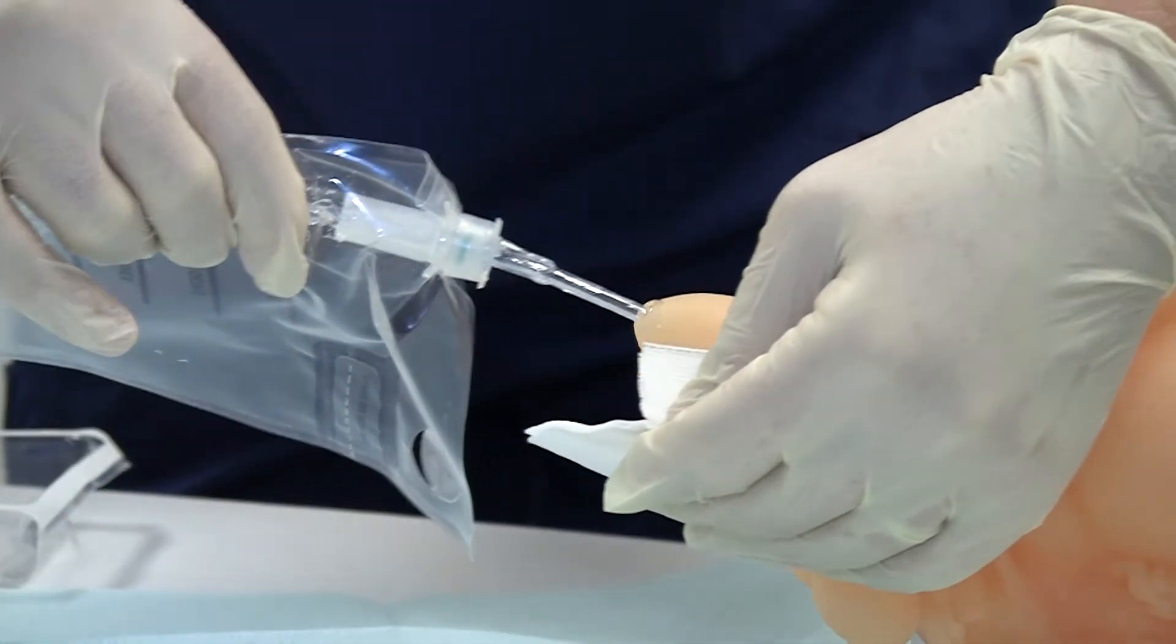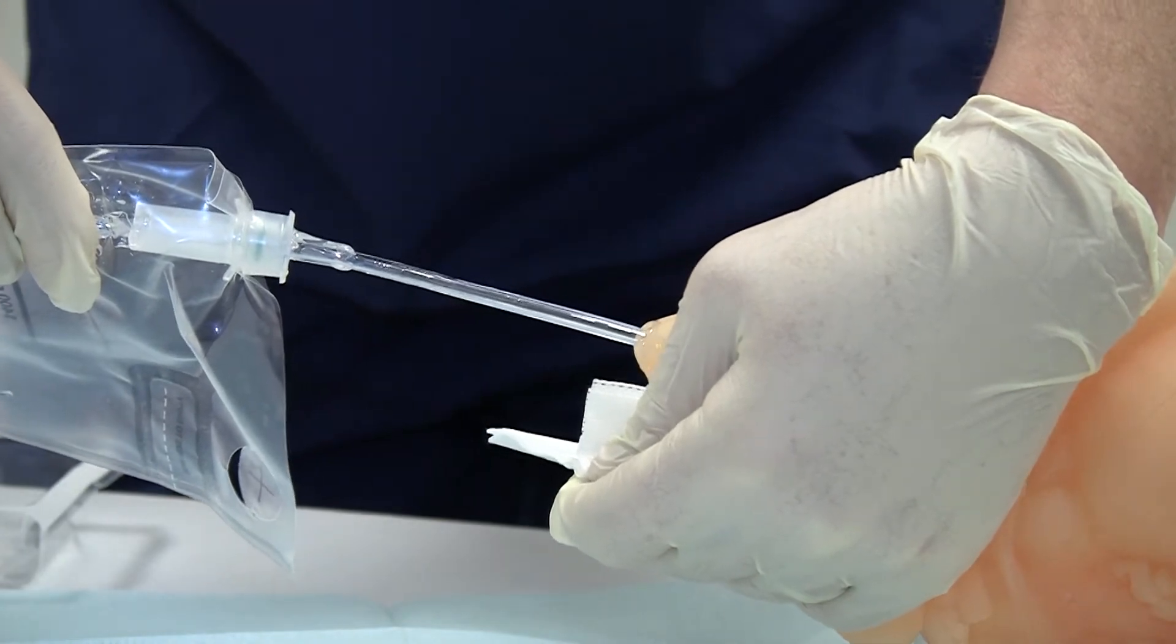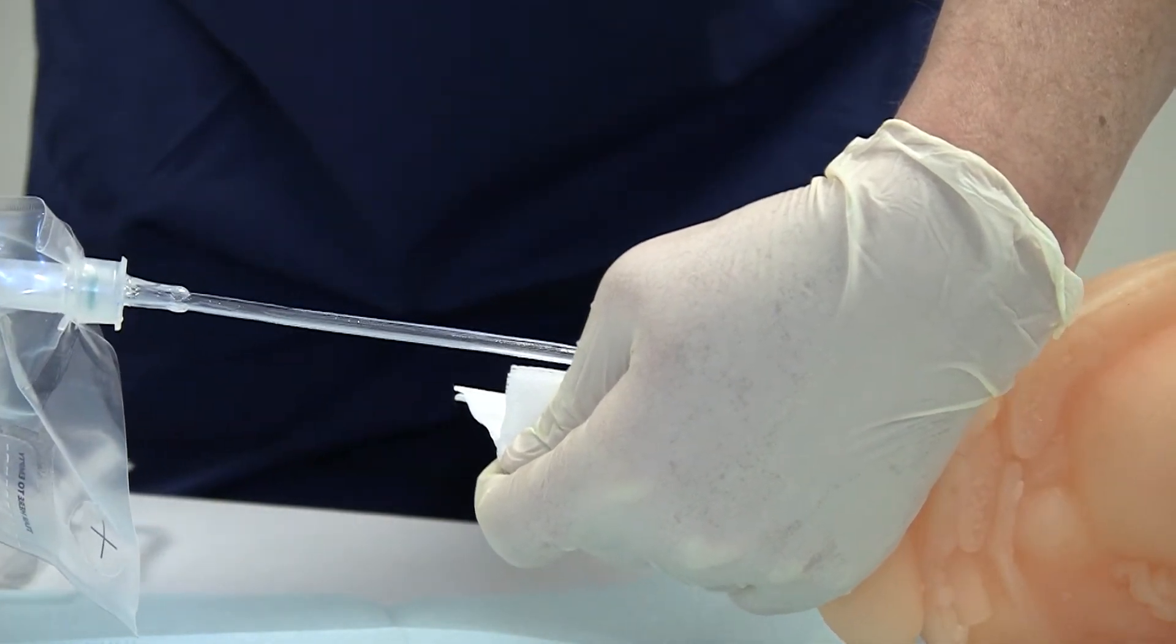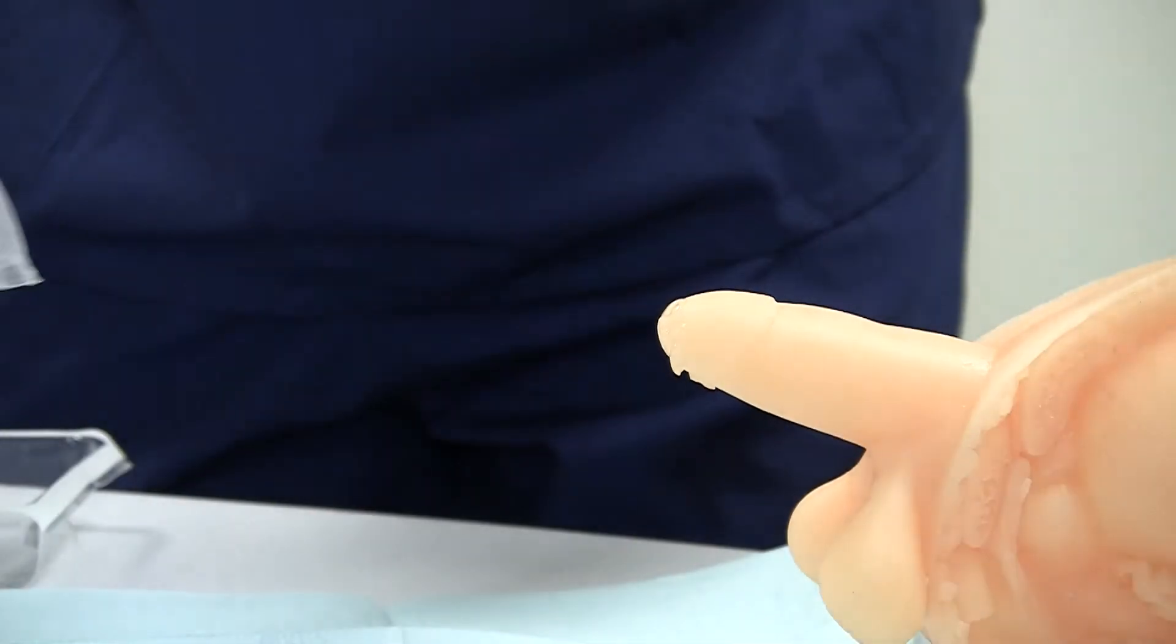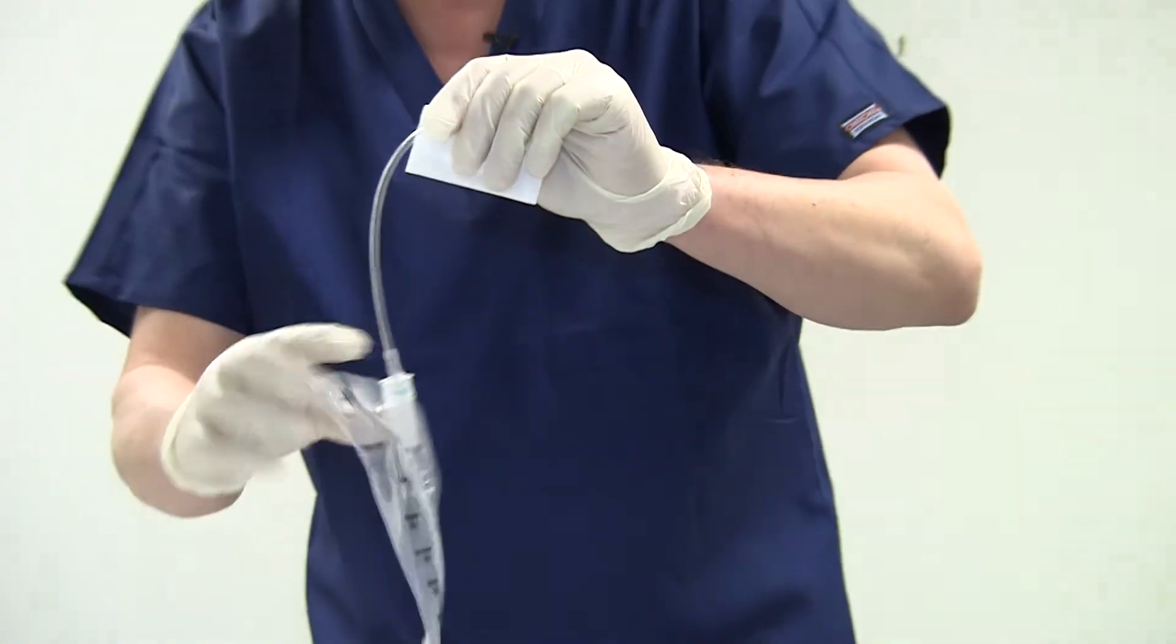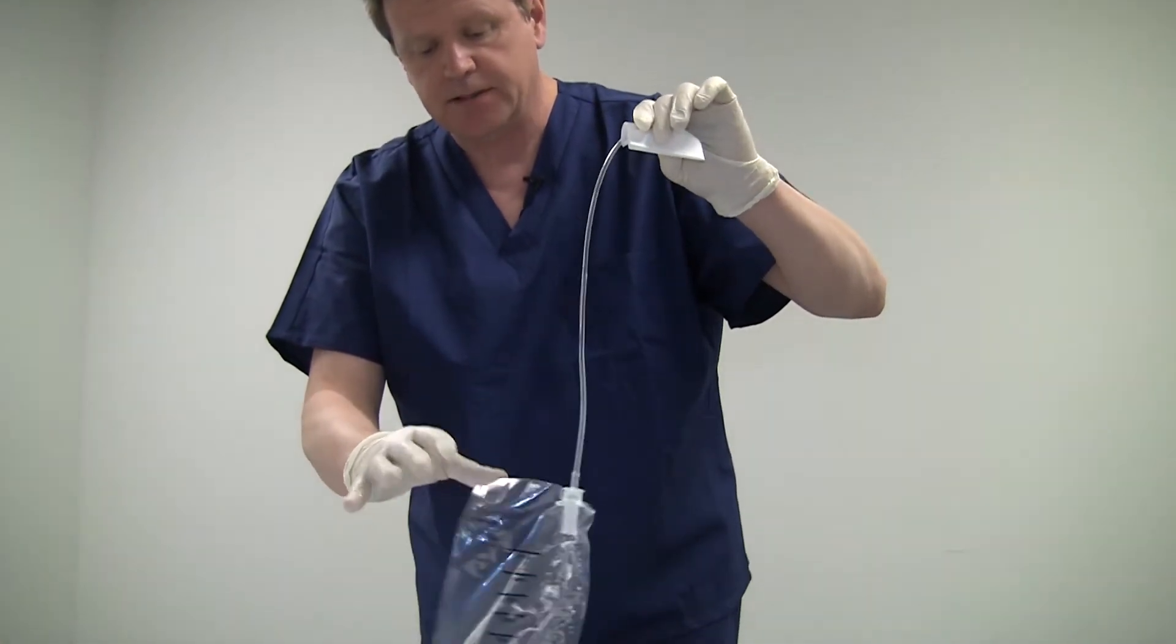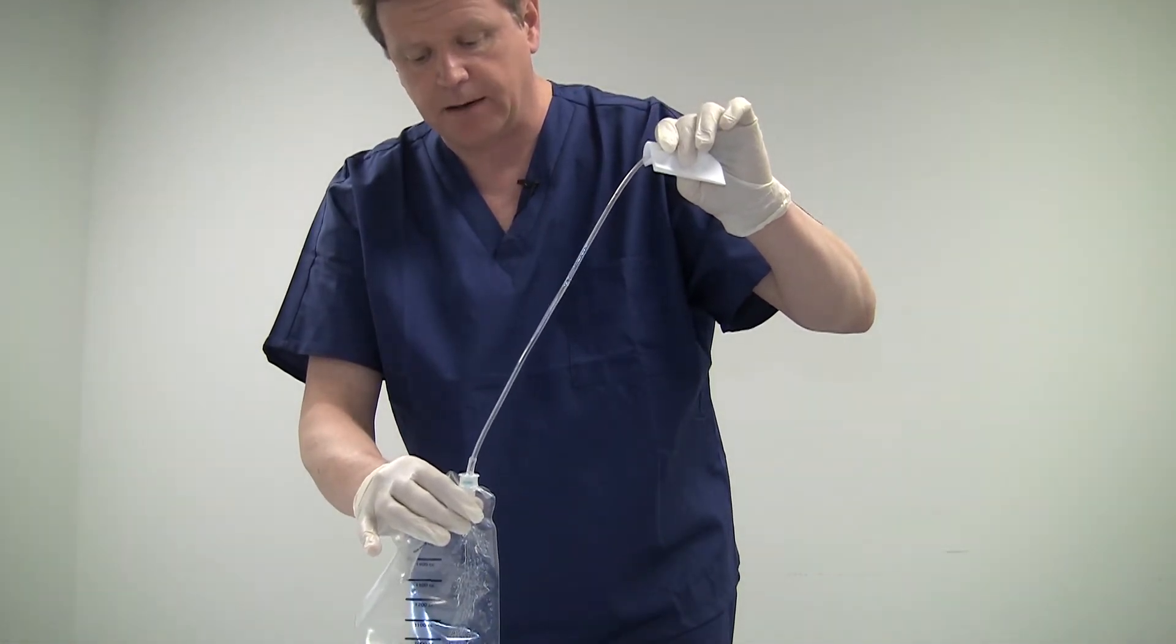I'm going to reach back and grab the gauze tissue in the kit. As the catheter leaves the body, you want to catch the eyes of the catheter with the gauze tissue so we avoid any spilling. Clamp off the eyes just like so. Hold it up so we don't have any spilling. Incidentally, if you let go of the bag, it's not going to separate. We have a flange in there that keeps everything together so it won't end up on the floor.